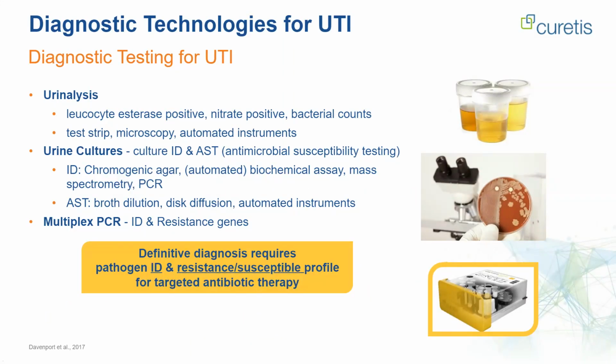The fastest and simplest diagnostic test is a urinalysis, which analyzes a sample of your urine looking for bacteria and blood cells. The doctors often carry out dipstick tests, in which a chemical strip detects an enzyme called leukocyte esterase that points to the presence of white blood cells.